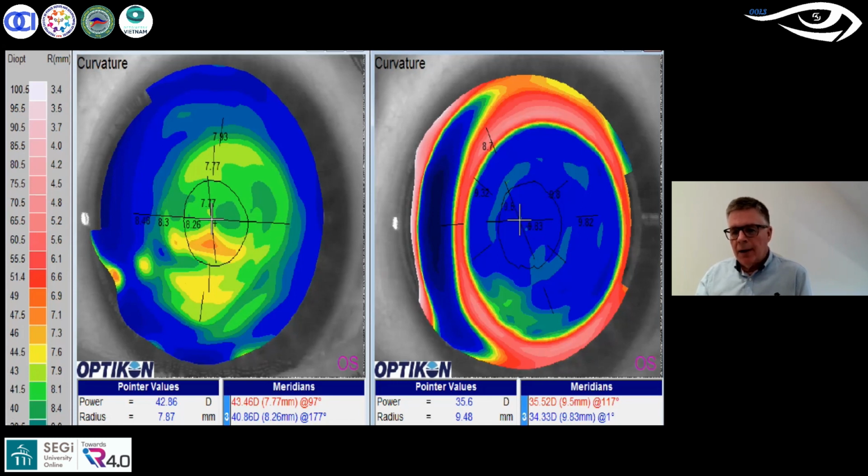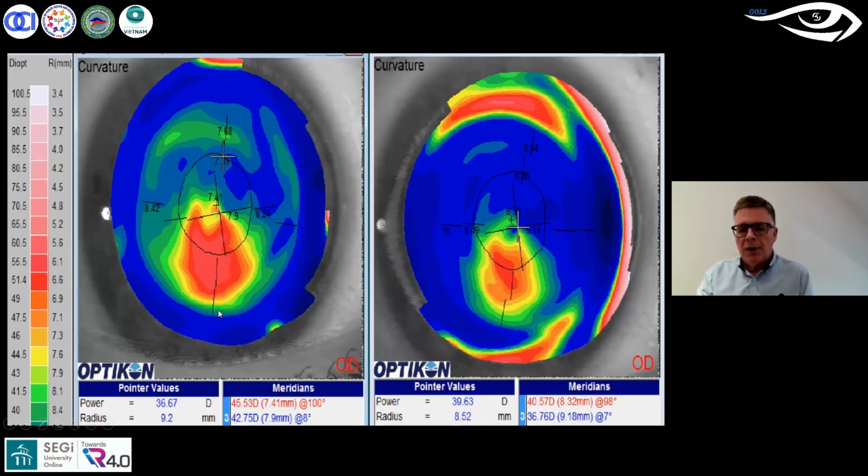His right eye demonstrated a more moderate level of keratoconus. You can see here we've got a moderate level of keratoconus, inferior cone, which starts to interfere with his vision. This is certainly on visual axis. Now, the image you see here is a soft toric contact lens. This is a 2-weekly replacement contact lens, and you can see the edges of the toric fitting zones here.